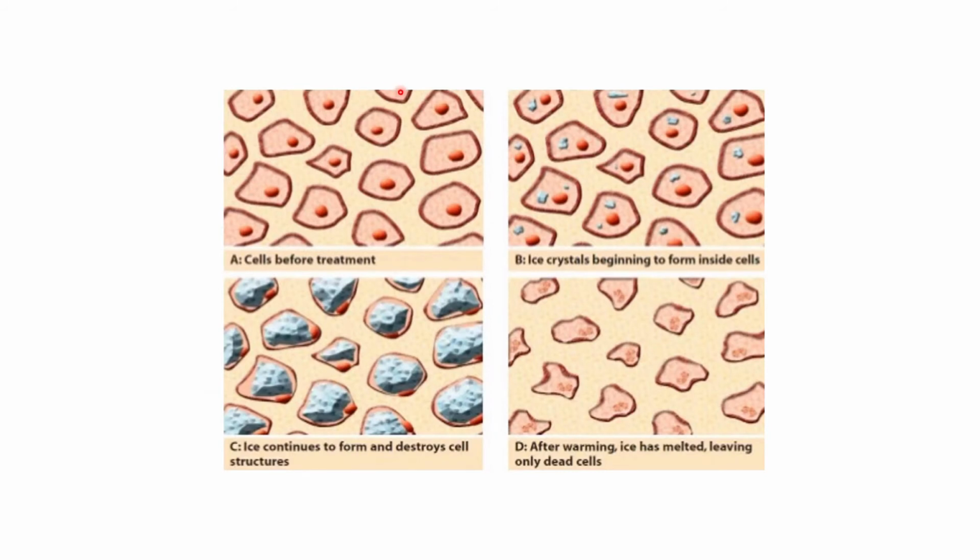بأول صورة راح نشوف الخلايا بصورة طبيعية قبل العلاج. بالصورة الثانية راح نشوف تكون ice crystals بداخل الخلايا. الصورة الثالثة ice crystals راح تكبر تاخذ يعني أغلب حجم الخلية. وبعدين بالصورة الأخيرة راح نشوف من يذوب هذا ice crystals راح يترك لنا خلايا ميتة.